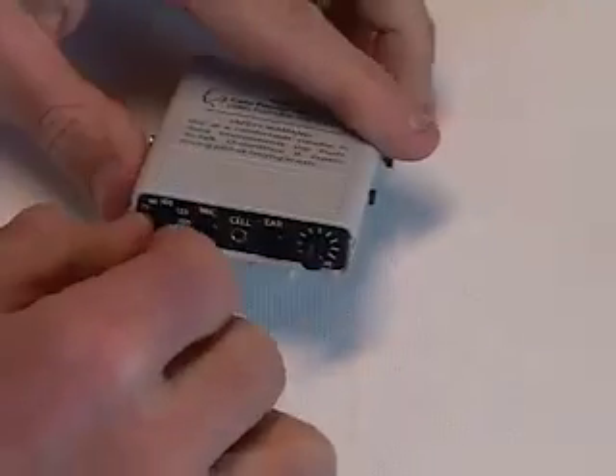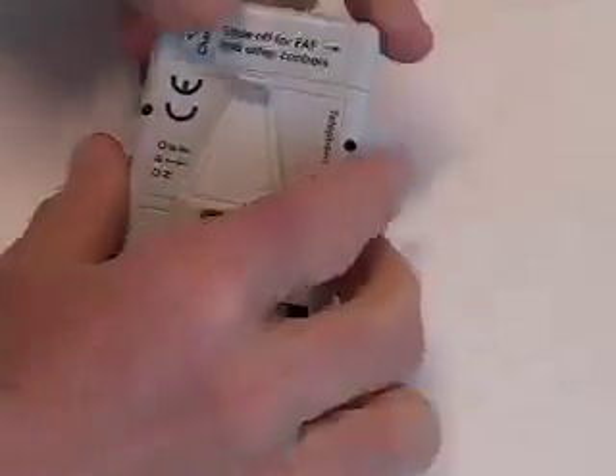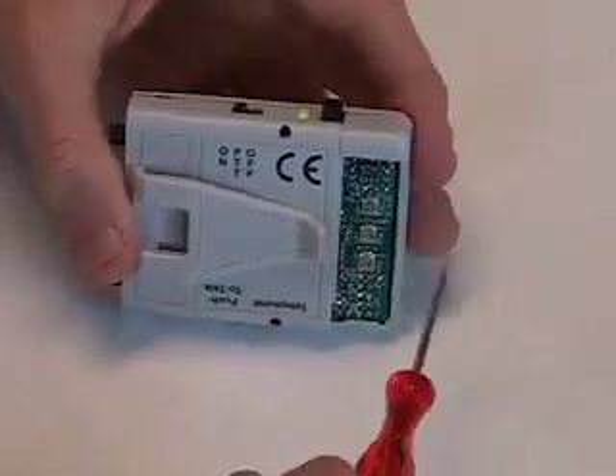The DAF control is full-sized, but the FAF control is small and behind this sliding panel. Adjust the FAF with the provided small screwdriver.